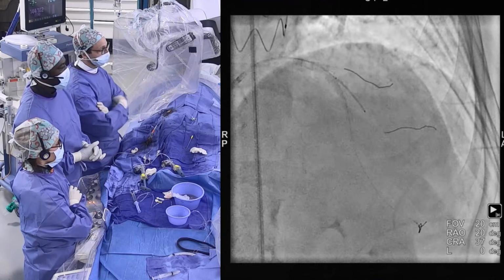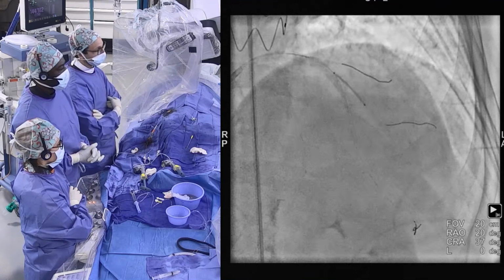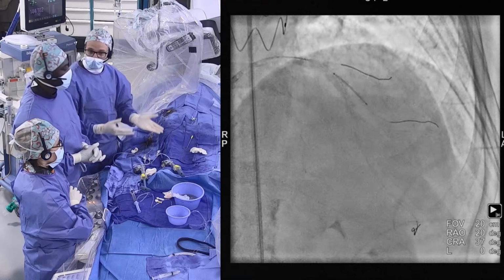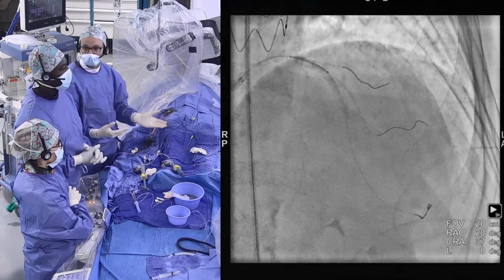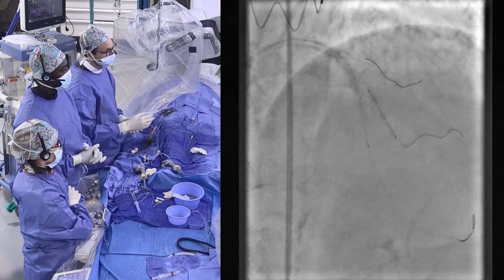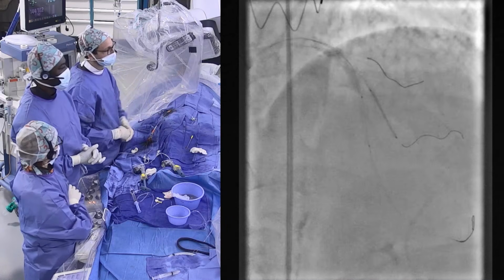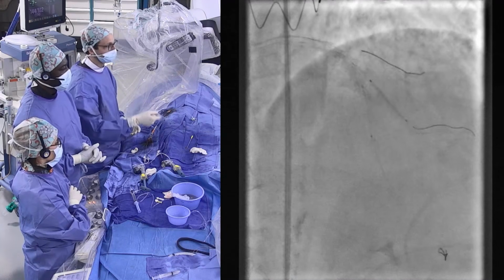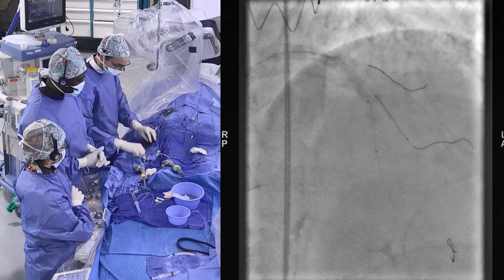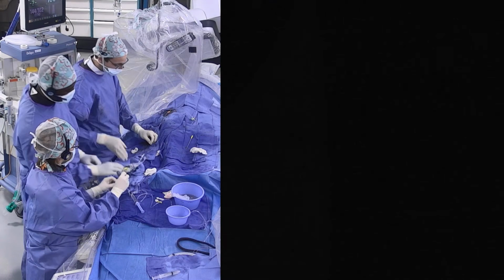You can appreciate that the 2.5 millimeter stent crosses the bifurcation really easily. We are now on a two-stent strategy, but as a bailout, so of course it would be a T and protrusion technique. Because the vessels are of small diameter, I like to engage my second balloon before placing the side branch stent, to avoid difficulty crossing afterwards. What is very important is to place the proximal part so as to avoid too much protrusion in this mid-LAD.